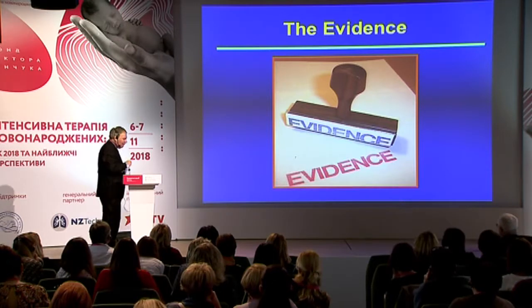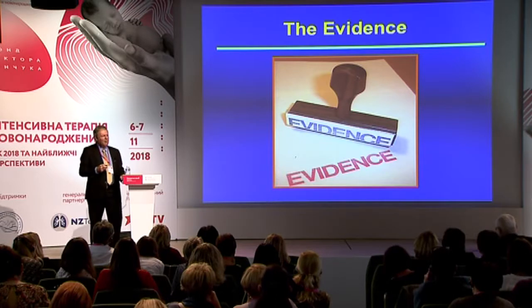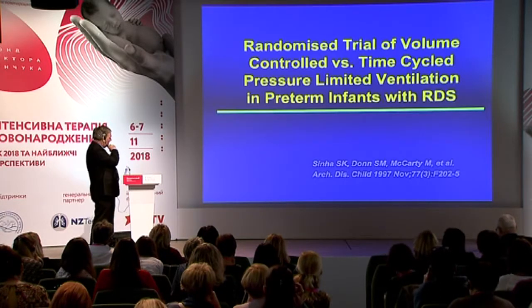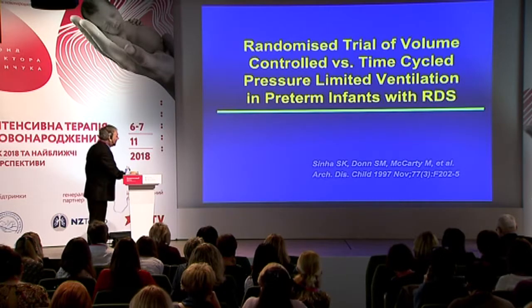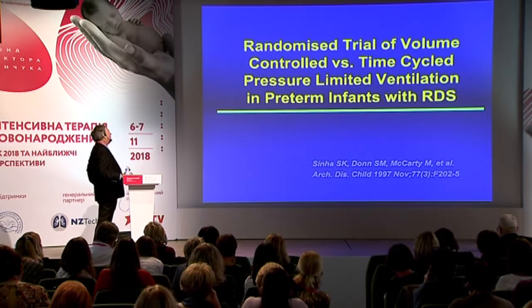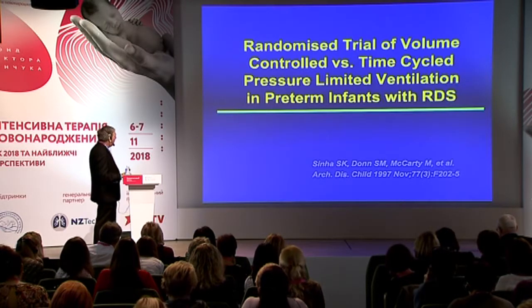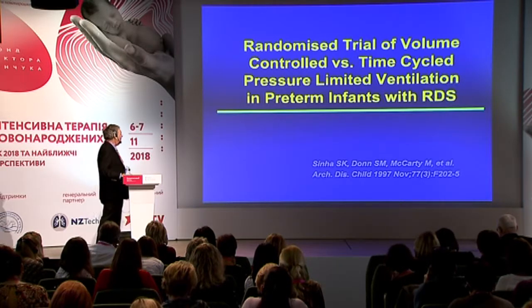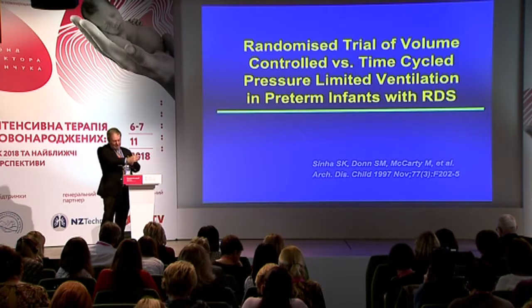Now, let's look at the evidence, and hopefully you'll come to the same conclusion that I have. If you go back to the literature, this is really the first randomized trial of volume-controlled versus time-cycled pressure-limited ventilation in a population of babies with RDS. And I take a lot of pride in this study.